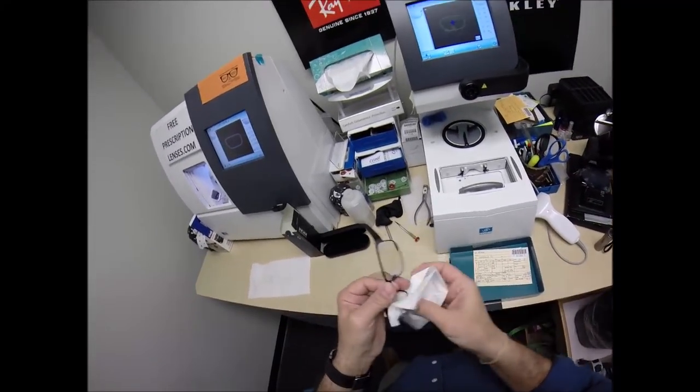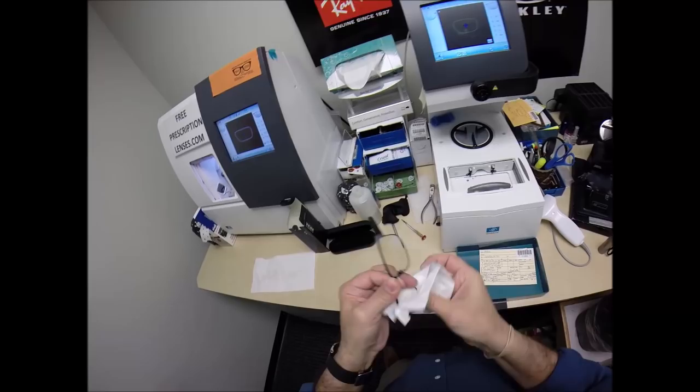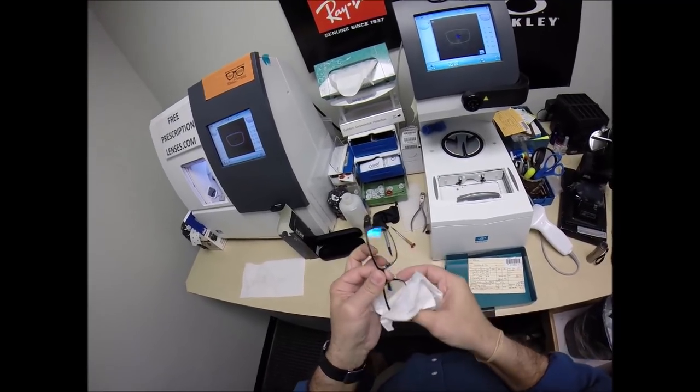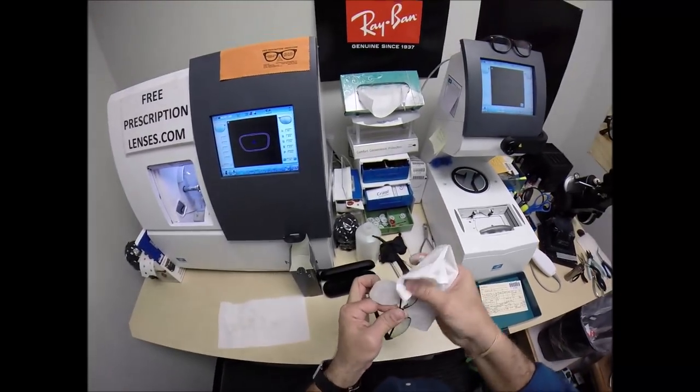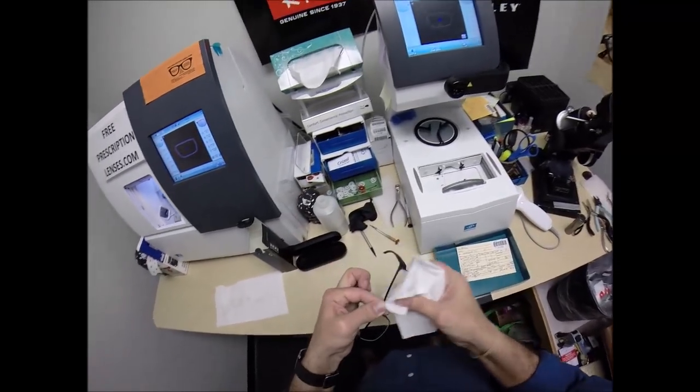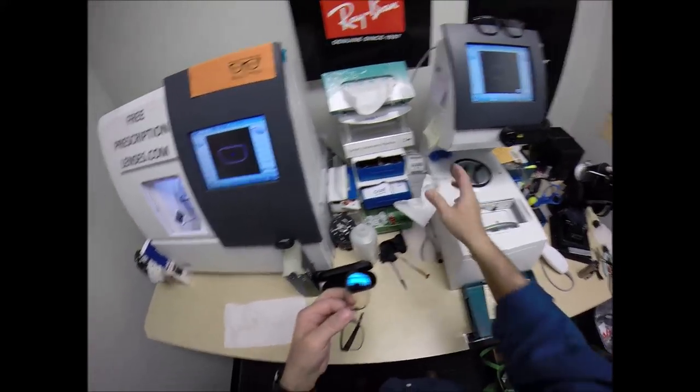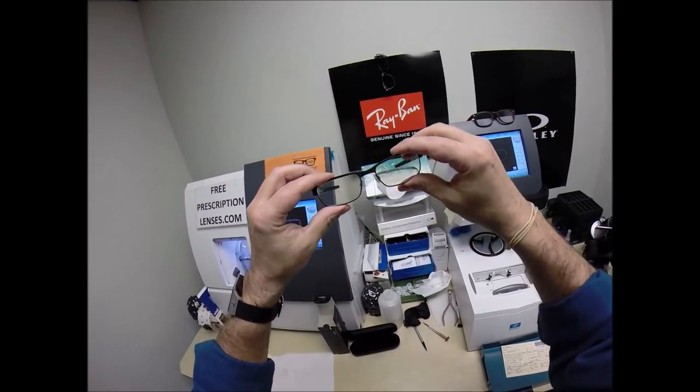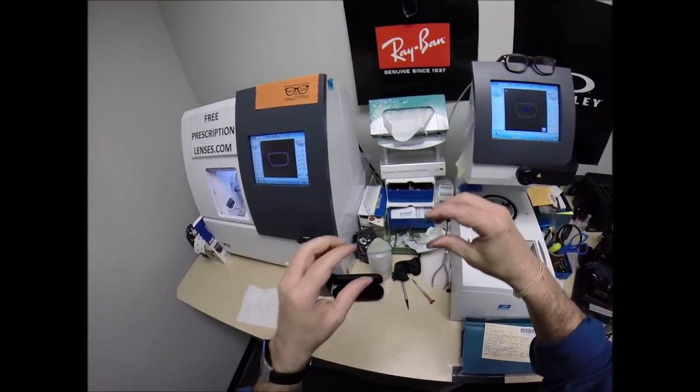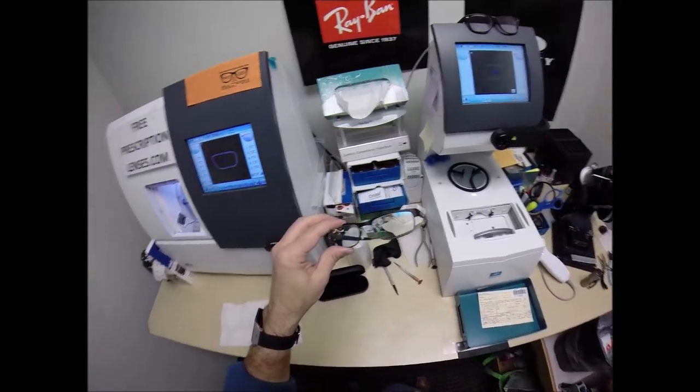But because of that statistic, 99% of all optical shops will do free adjustments if you ask them. So just stop by your local place and tell them if it's too loose or too tight or high on one side. They'll know what to do. It only takes about 30 seconds to a minute to adjust a pair of glasses perfectly.